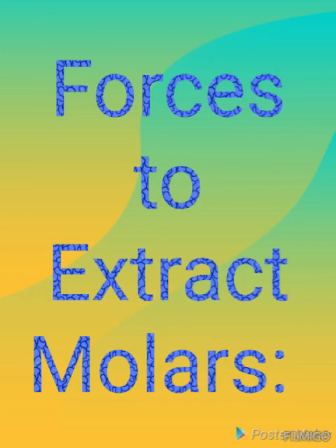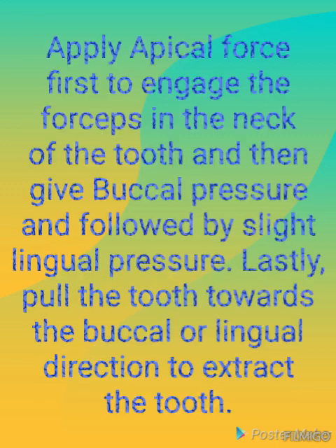Next, we are going to see forces to extract mandibular molars. What are the forces or movements? Apply apical force first to engage the forceps in the neck of the tooth, and then give buccal pressure, followed by slight lingual pressure. Lastly, pull the tooth towards the buccal or lingual direction to extract the tooth. So we have to give buccal pressure and then slight lingual pressure and pull the tooth towards the buccal or lingual direction to extract the tooth.